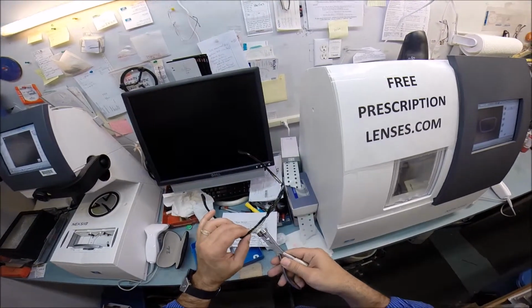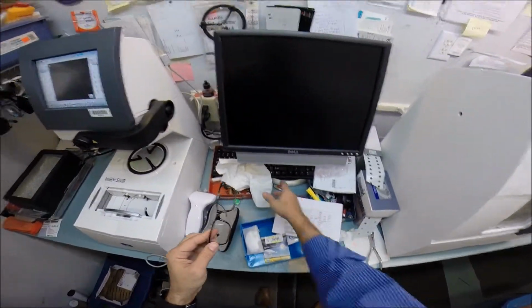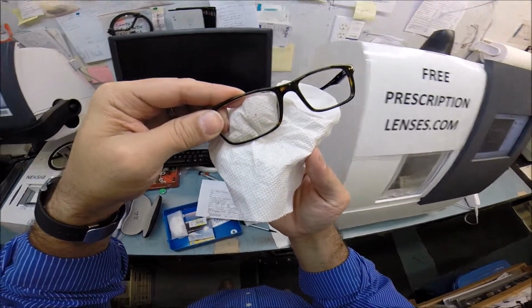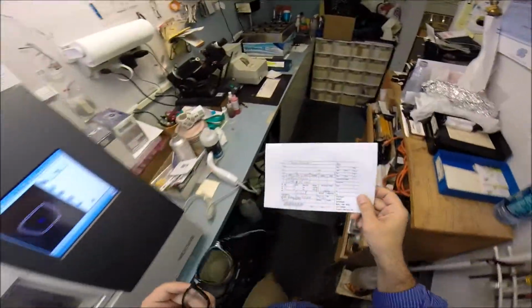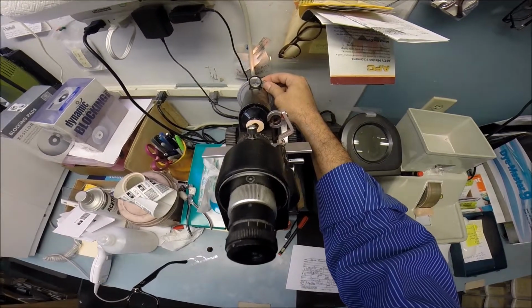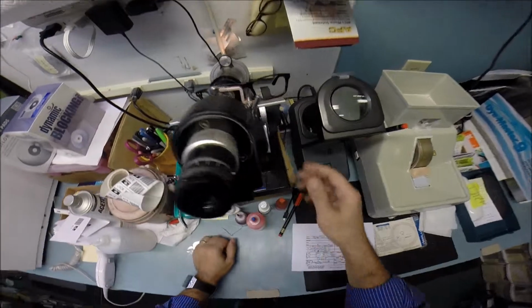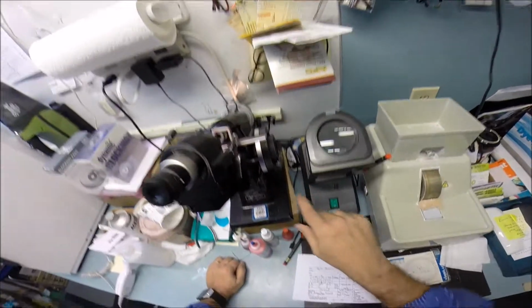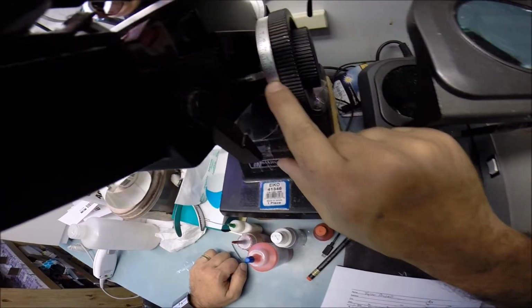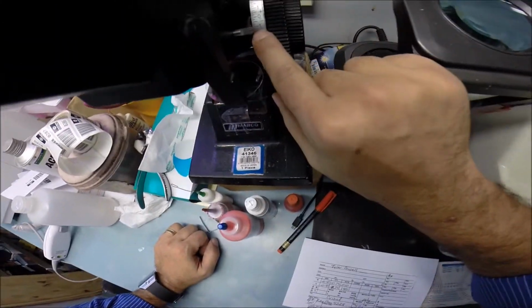While your left lens is cutting, I'm going to continue to work on the right. I'm going to pull that block off. I'm going to draw your lens off, leaving that red dot. That is your optical center. I'm going to use that red dot to put it into my lensometer. I'm going to spin the axis wheel back to 10. And just above that, right over that red dot, I'm going to read the power. And I am reading -.50, which is exactly halfway between 0 and 1. I need to get a better light down here. Check your astigmatism correction. And I am getting 1 1/4.